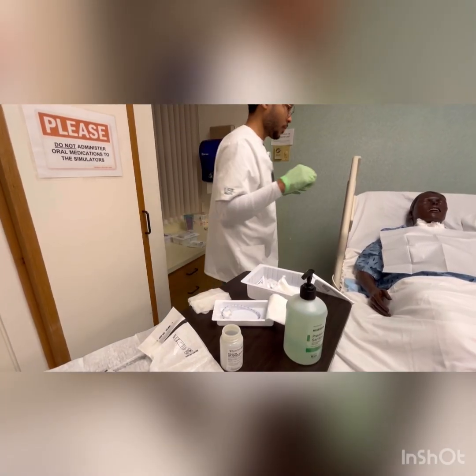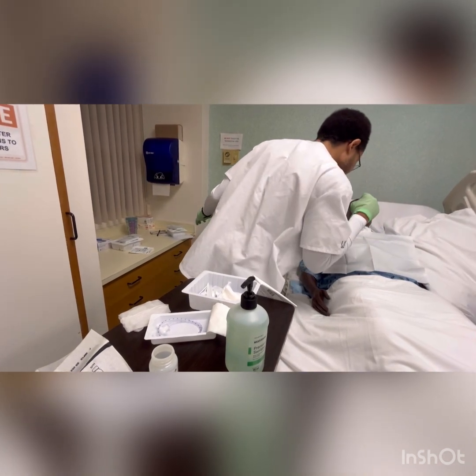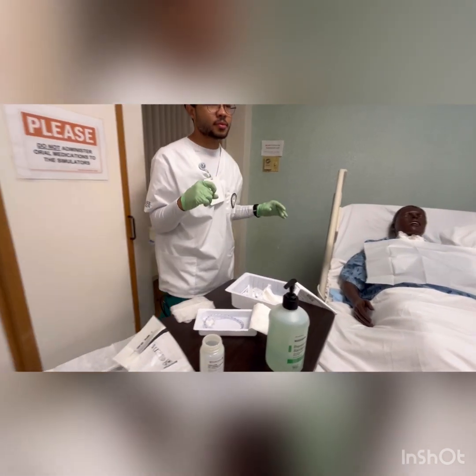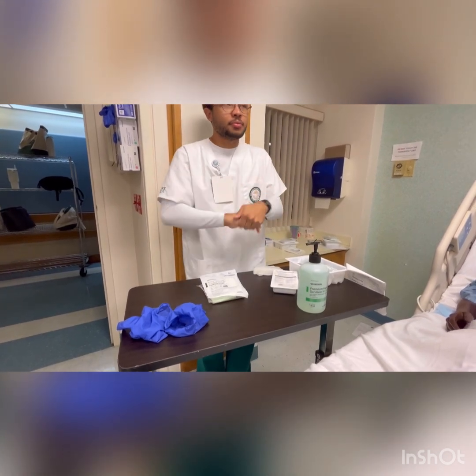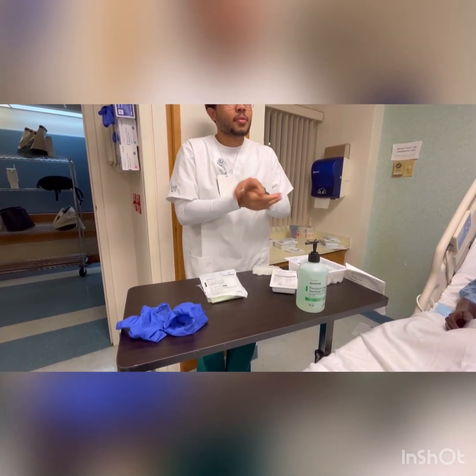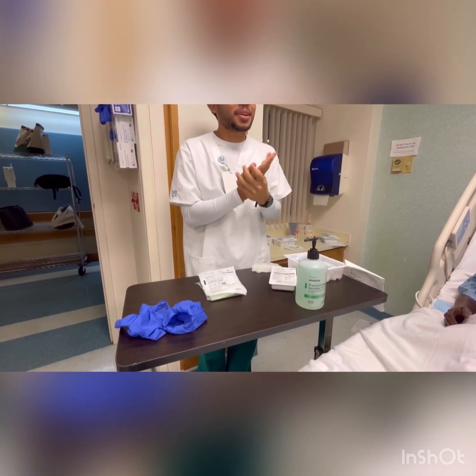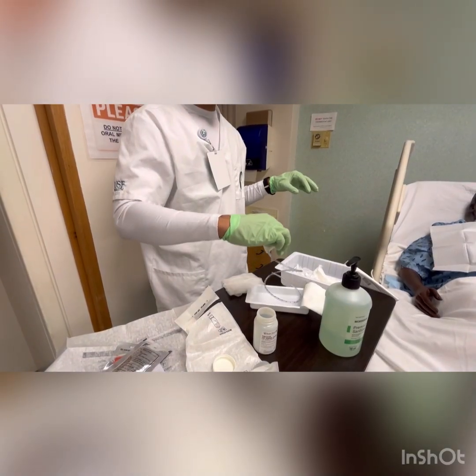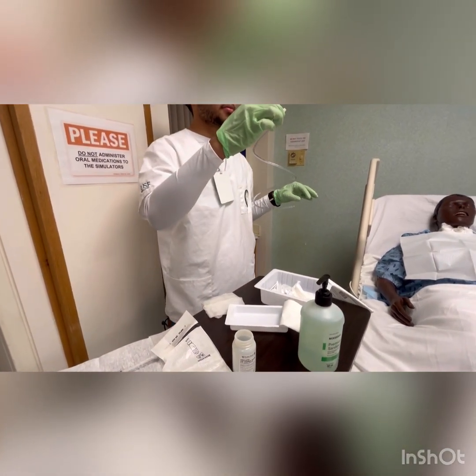Pre-measure the catheter insertion distance for 0.5 to 1 centimeter past the distal end of the endotracheal tube. The endotracheal tube normally sits between the 3rd and 7th centimeter above the carina. Remove gloves and perform hand hygiene, then don sterile gloves. Pick up the suctioning catheter with the dominant hand and attach it to the connection tubing. Keep the dominant hand sterile.